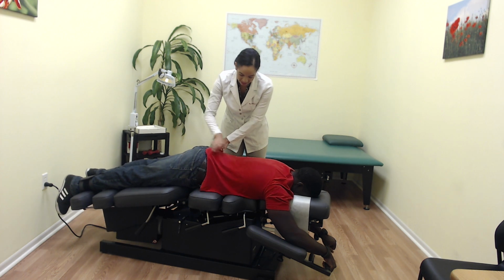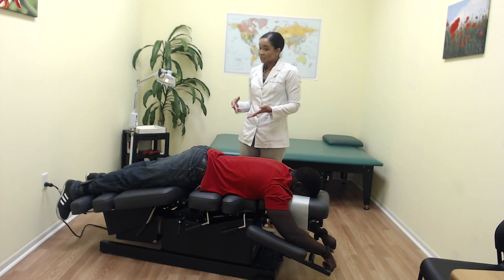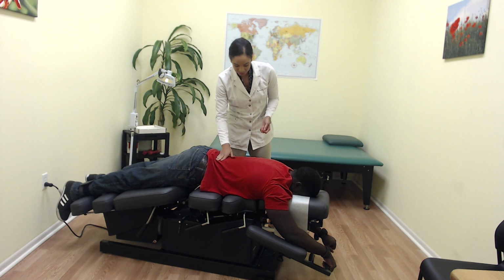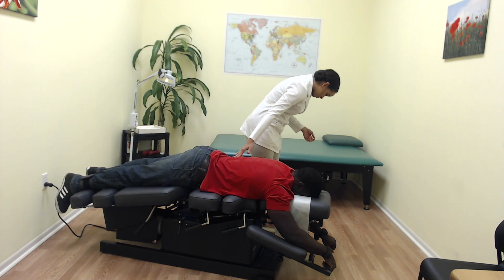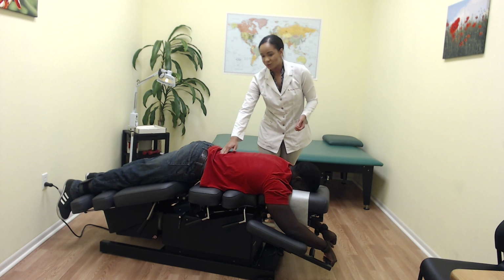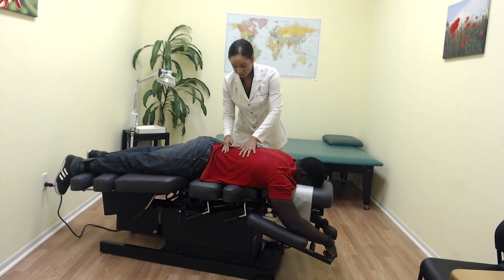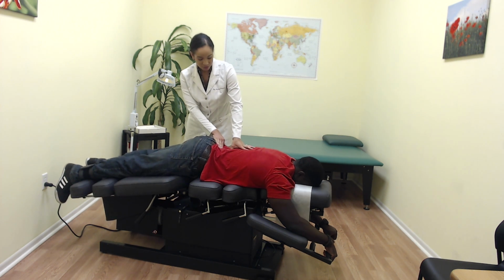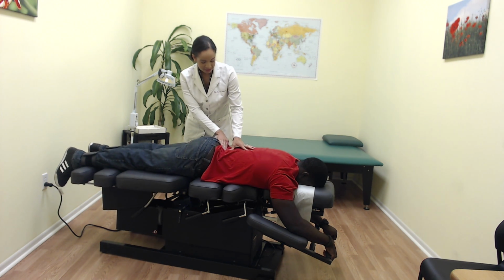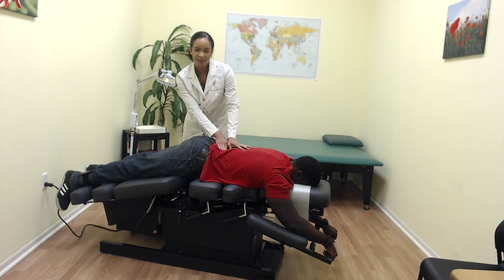What's really great now is I can either leave the room, or I can put maybe some heat on the patient to help increase the blood flow we're getting to that area. I can also work on some of those muscles, which I'm actually going to do right now. It lets me do those two things at once. So what I like to do is put some pressure into those joint spaces, again, to facilitate opening up those joints in the low back.